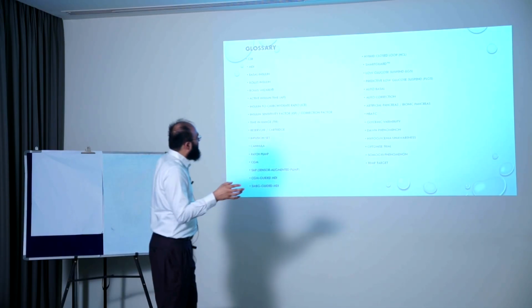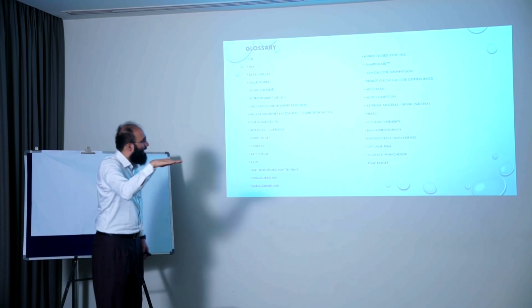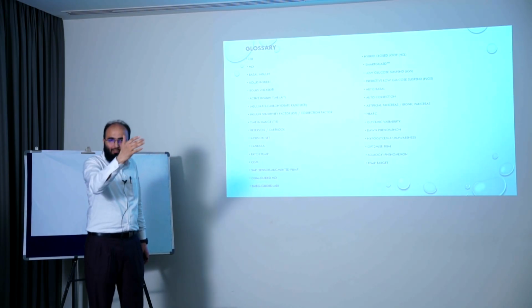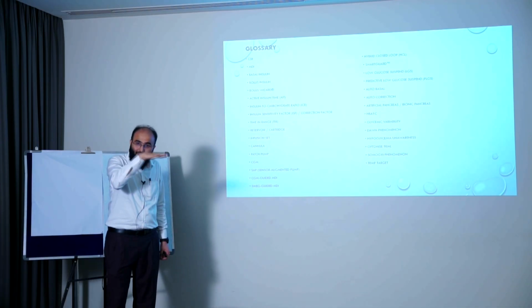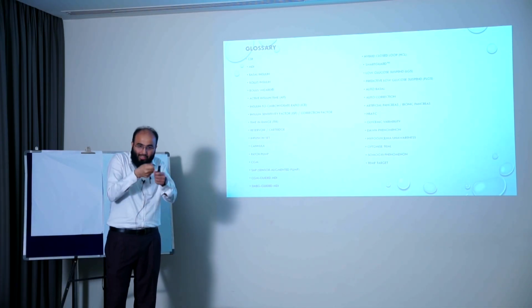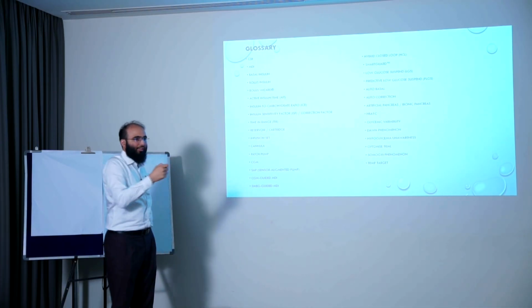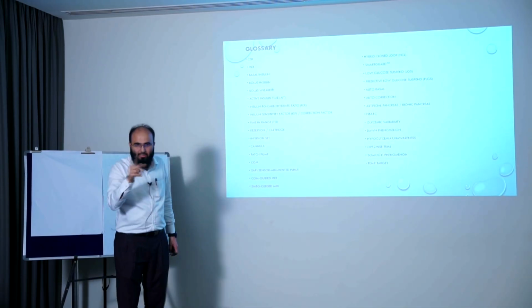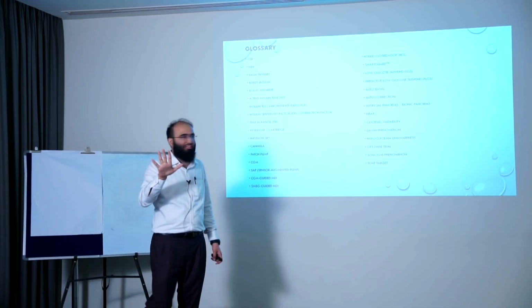And auto basal is that rate that you set. Auto correction is when your sugar is going up, and maximum basal was given for that hour. Now the pump is trying to give some corrections. That is auto correction, and this auto correction is almost done every 5 minutes again. Auto correction is also done every 5 minutes.